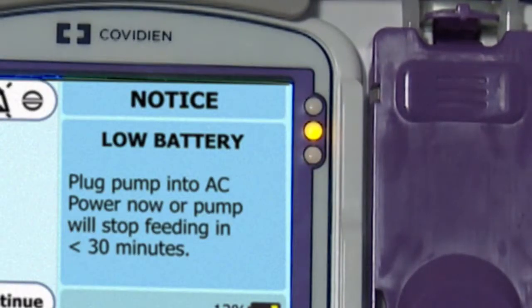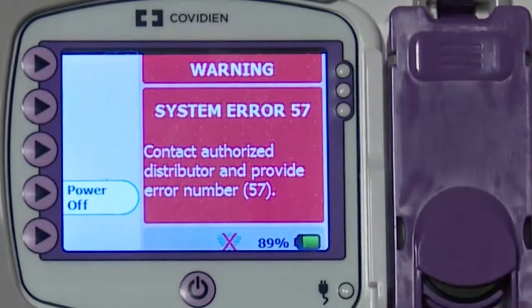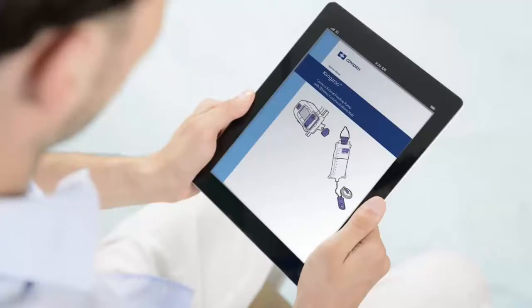A solid yellow light indicates an informational notice. A blinking yellow light indicates a caution. A blinking red light indicates a critical warning. For information on specific alarms, consult your operator's manual or customer service if you need additional information.